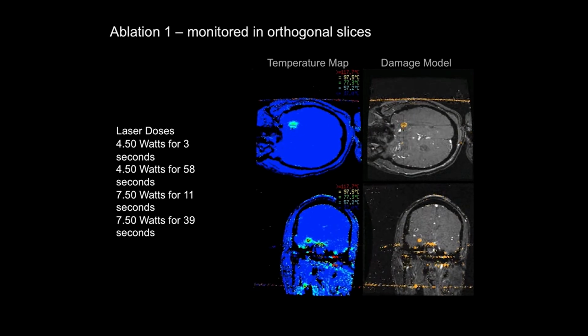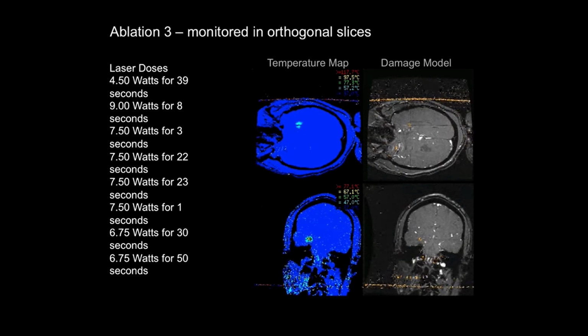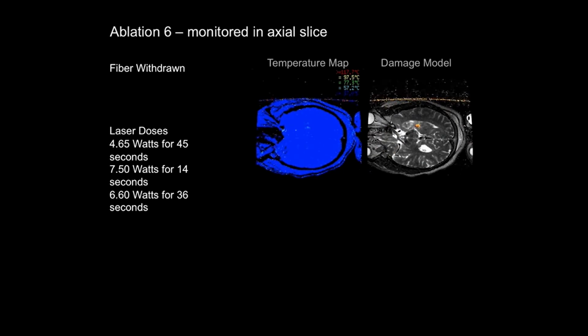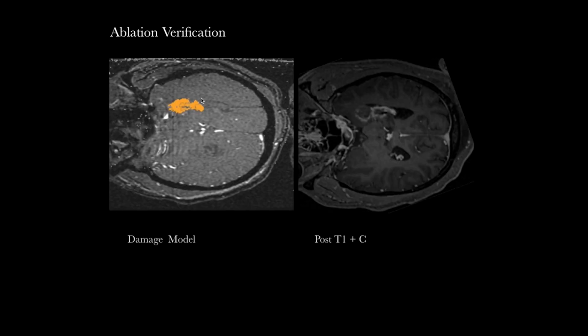So this is the delivery of energy or heat to first the amygdala, and then we pull the probe back and deliver the same energy towards the head of the hippocampus and further back into the body of the hippocampus and then more towards the tail of the hippocampus. And as this is all completed, this is the last ablation on the back end of the hippocampus. We then obtain a post-ablation contrasted MRI scan, which shows the zone of ablation here. And here is a verification: this is the heat damage estimate, and here's the ablation.